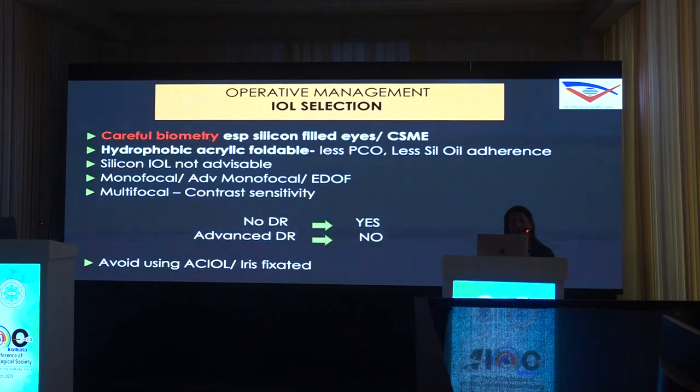The kind of IOL that we choose will also depend upon whether the patient is wanting a monofocal lens, or in this era of multifocal lenses, patients do insist many a time. But we need to again see whether they have any posterior segment involvement, in which case a multifocal lens would not be the best choice for them. Mostly we like to choose hydrophobic acrylic lenses which cause less PCO, and in these cases, if they go on to VR surgery, also the silicone oil adherence is less to hydrophobic lenses.